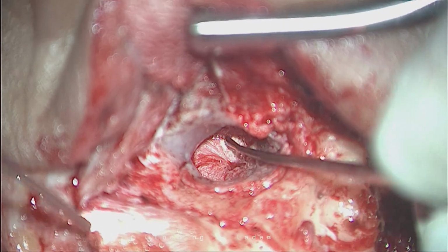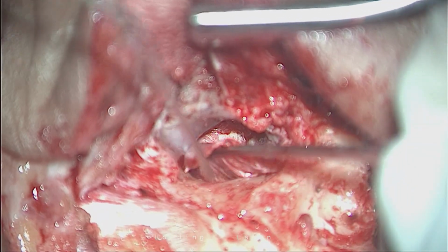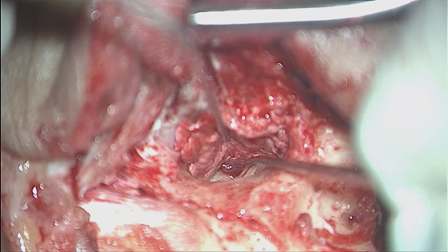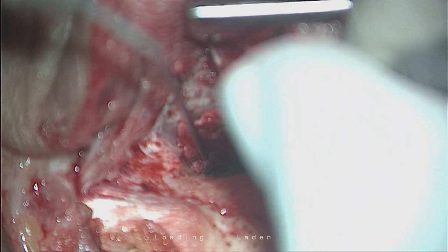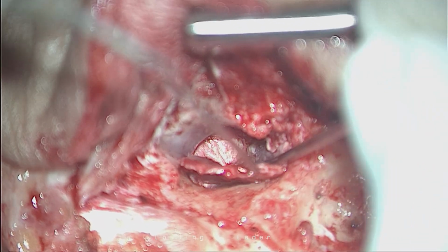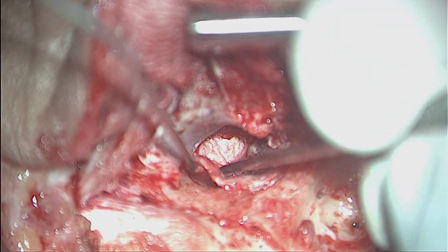Now the third part of the grafting is to ensure 360 degrees that my graft is lying in between the mucosa and the rest of the two layers. I am checking whether this sandwich is in order or not. Yes. See this, posterior superiorly it is in order, posteriorly it is in order. Yep.